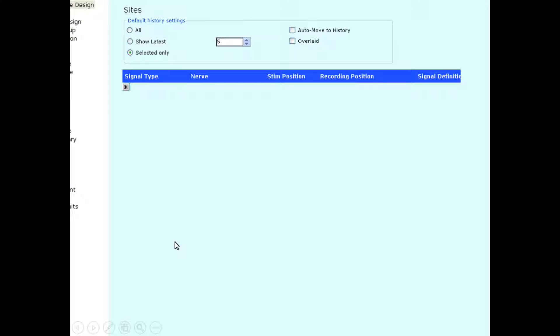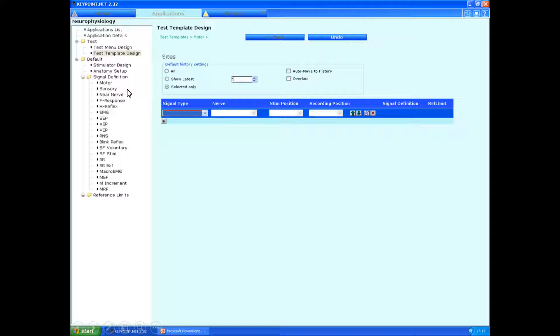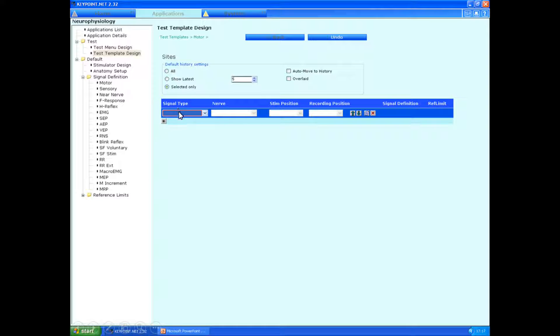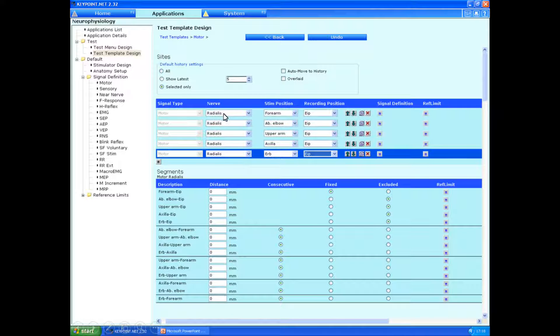On the signal type, click on this star. And we just click down on the little box over here, and we can choose motor, sensory, F-waves, whatever. And here we're setting up the radial motor study, so we go for motor. And then we go for the radial nerve.